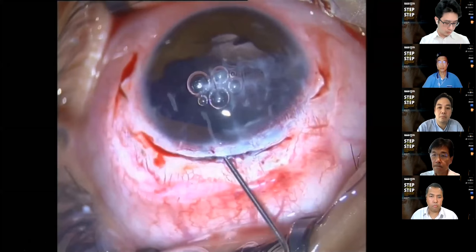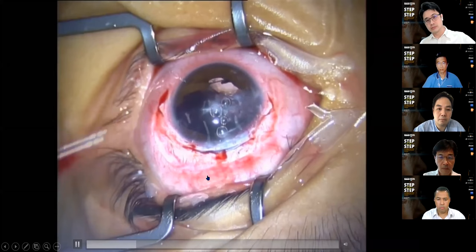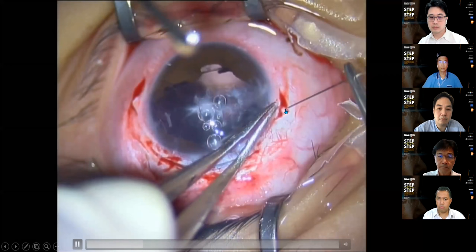Now, preparation of the retriever needle: I like to bend a 27 gauge needle so that the bent area serves as a kind of grip for the straight needle of the Prolene when it goes in, so that when you pull it, you retrieve it, and it will come out. Okay, one thing I want to talk about is the orientation of the needle. When you go in, I make it almost perpendicular to the scleral surface.